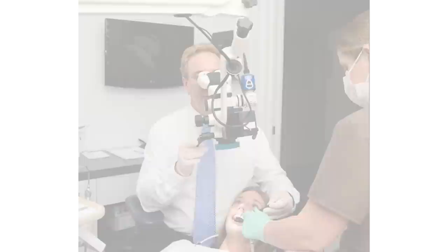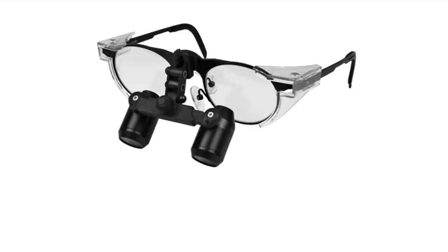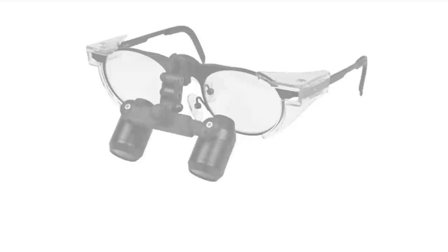All dentists should be using some kind of magnification. The ones who do are using dental loops that have a magnification of 2.5x to 3.5x. In my opinion, that's not nearly enough.